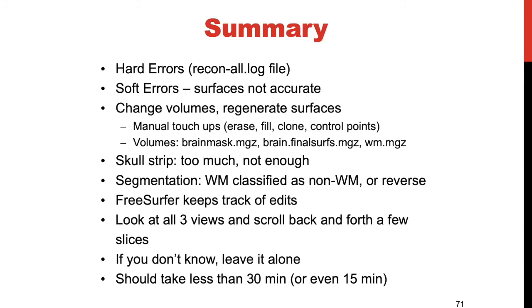If Dev, you want to add on to that. Yeah, sorry, I couldn't find the unmute button. I think it used to be a lot more utilized in editing, but for now, I think Ren said it best: we're just using our brain mask and our white matter mask.